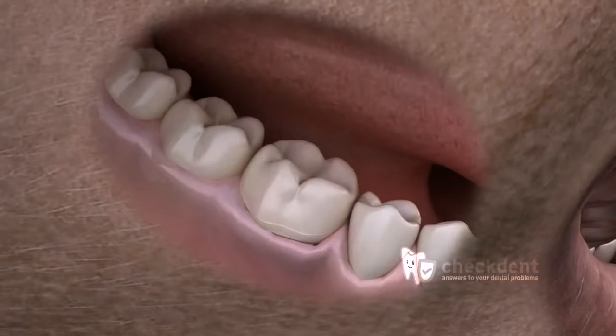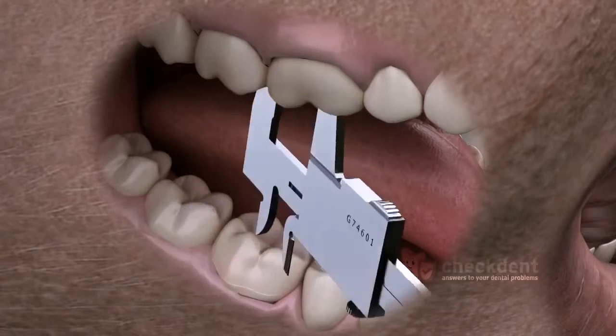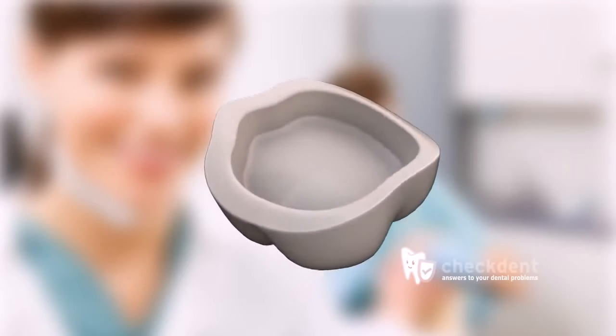Aesthetic characteristics of a crown. An artificial crown should always achieve the functional aspects, in effect the right fit against the opposing teeth, as well as in the socket. This is the primary responsibility of the dentist. On the other hand, the aesthetic appearance is the primary responsibility of the dental technician who fabricates the crown.